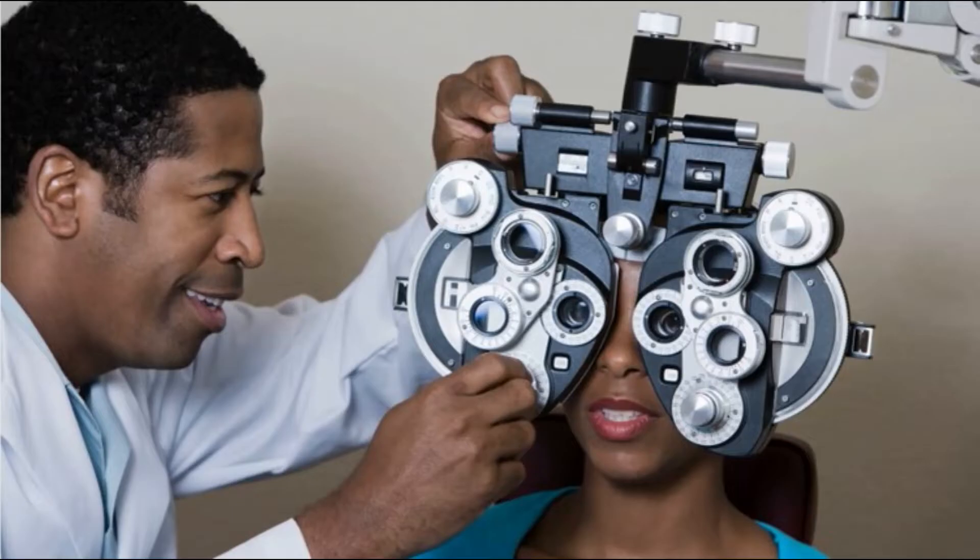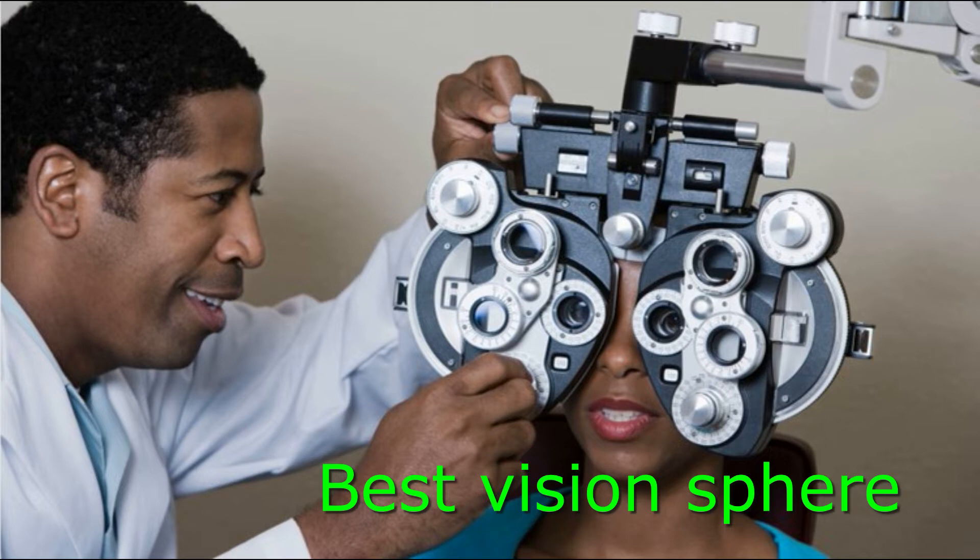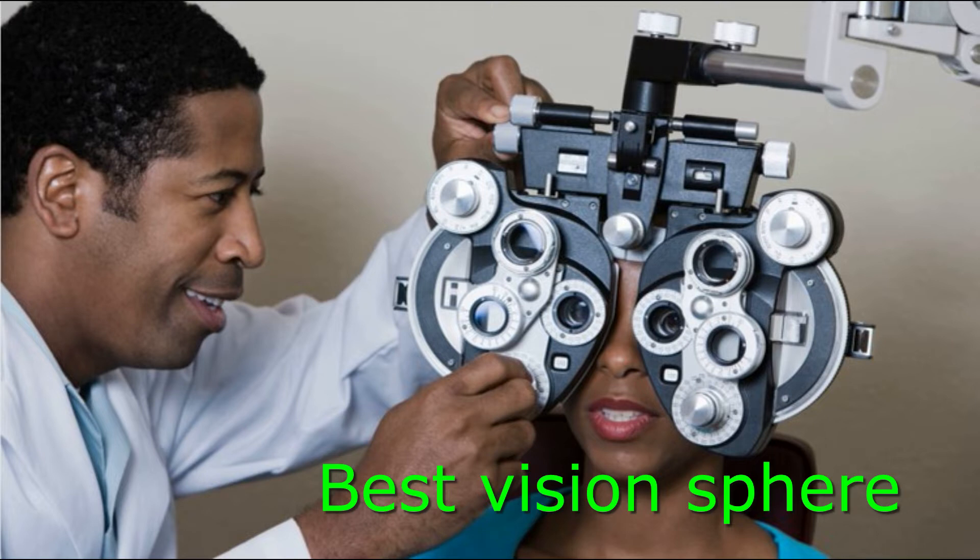The next step is to get the best sphere. To do this, start with the objective results or the visual acuity guided sphere as we have just discussed. We normally start with the right eye, so occlude the left one. At this point, you do not know if a patient is myopic or hypermetropic, so you need to present both the plus and the minus lenses, asking the patient if any of these lenses improves their vision. Start with the plus lenses before the minus lenses, as this helps to relax their accommodation. If they can read more with the plus lenses, insert the plus lens in the trial frame and let them read to the smallest possible line.